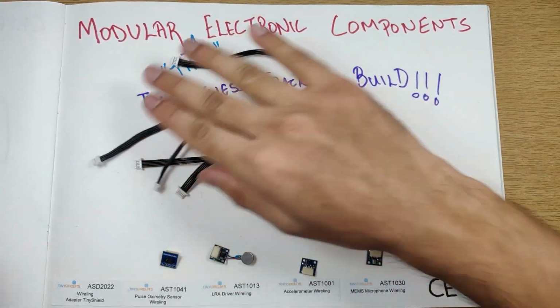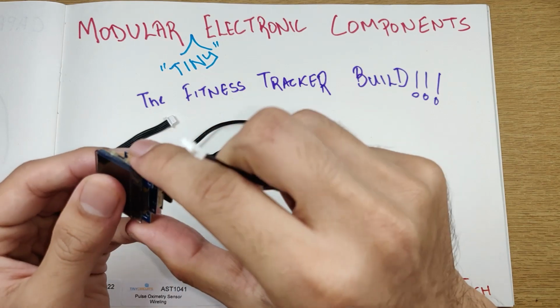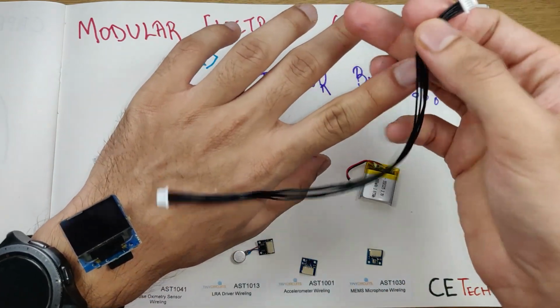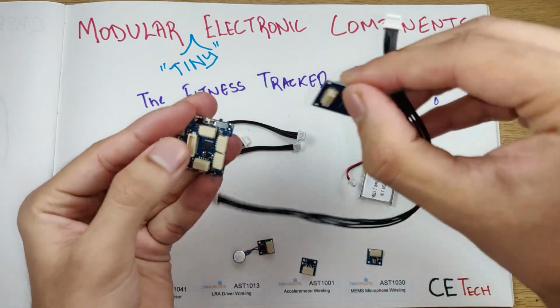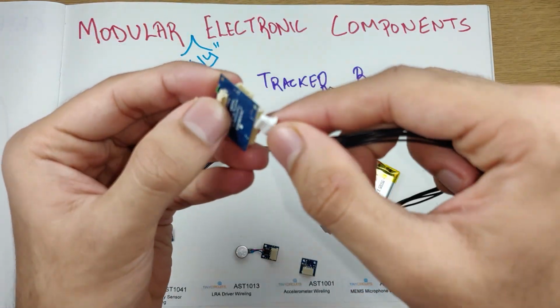Now we have some different size wires. I'll be using the longest one for the oximeter, as I plan to put the display around my wrist and the oximeter will be present around my finger, so that gives a good length. We'll be attaching the oximeter to port number 1. For that, I'll just quickly remove this so that we are able to see the ports which are on this side. So that's port number 1.